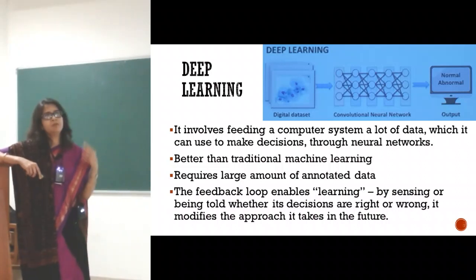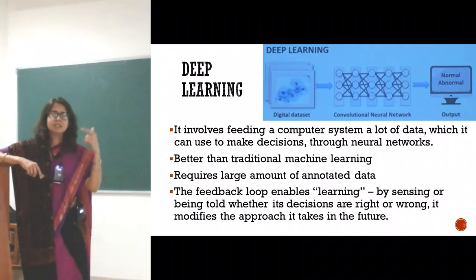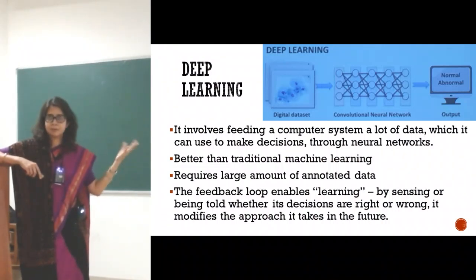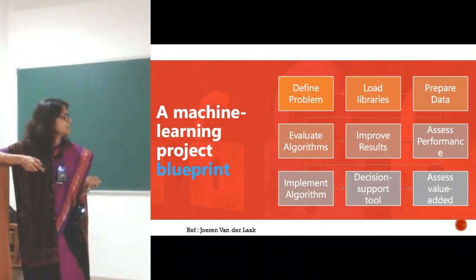But when you give the computer thousands and thousands of breast cancer images, along with the results that this person failed or this person is surviving, based on that information the computer can pick up features in morphometry which are not visible to the pathologist's eye. So that is what deep learning is. And that is what we are expecting will change the way we diagnose cases in future using machine learning.